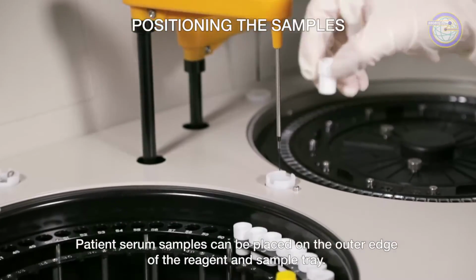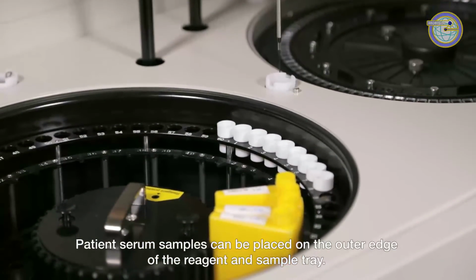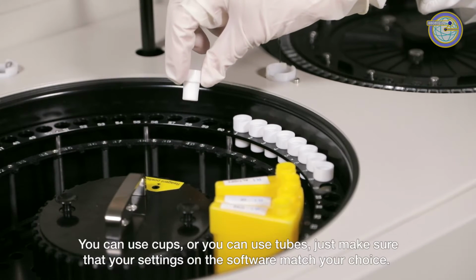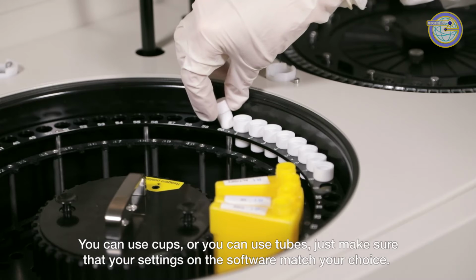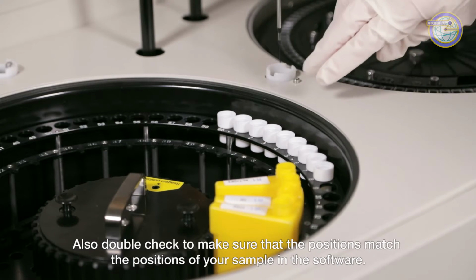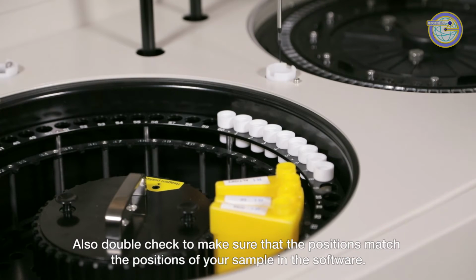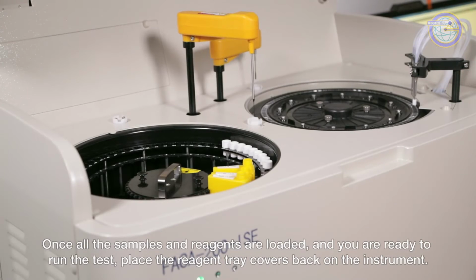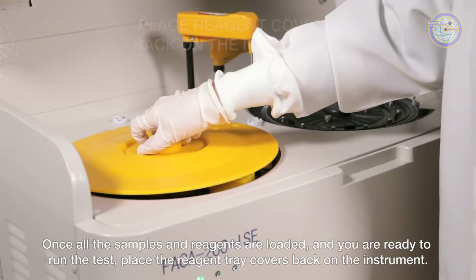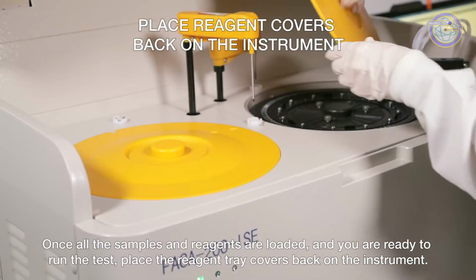Patient serum samples can be placed on the outer edge of the reagent and sample tray. You can use cups, or you can actually also use tubes. Just make sure that your settings on the software match your choice. Also double check to make sure that the positions match the position of your sample on the software. Once all the samples and reagents are loaded and you are ready to run the test, place the reagent tray covers back on the instrument.